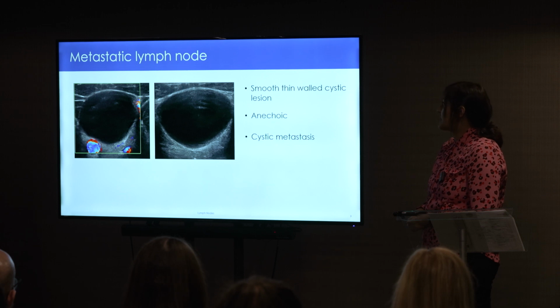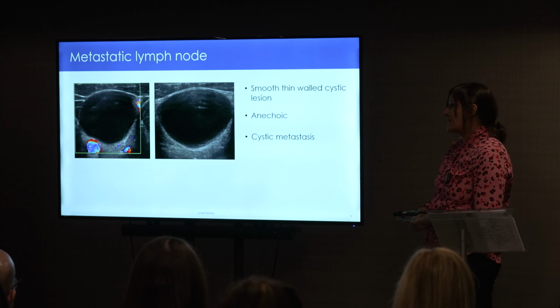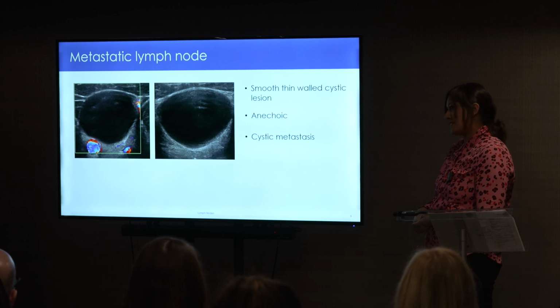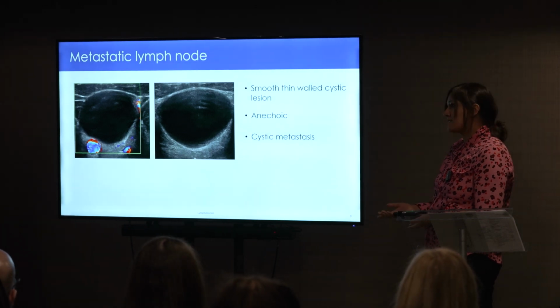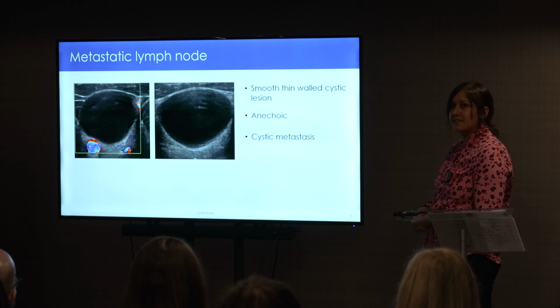I think the key thing is its location. I believe this is at level 4, if that was right. Also, the patient was clinically well. Is that correct? Yeah, 3 years old. Yeah, absolutely terrifying. So the only thing that she presented with was this at the start. So this is actually a cystic metastatic papillary thyroid carcinoma.